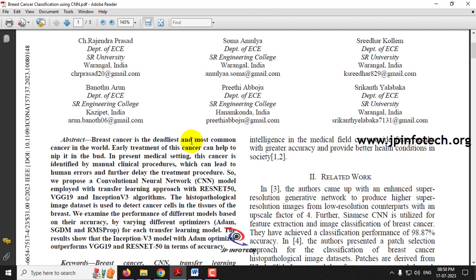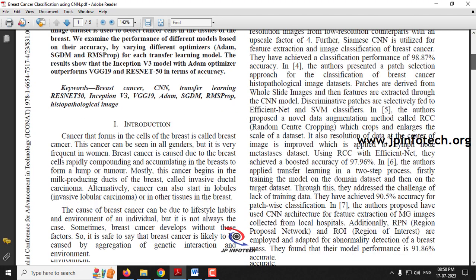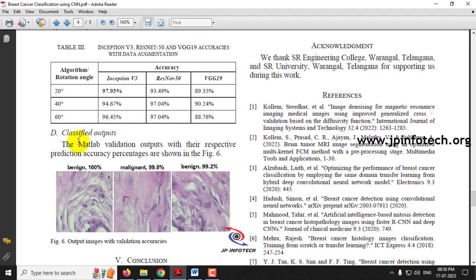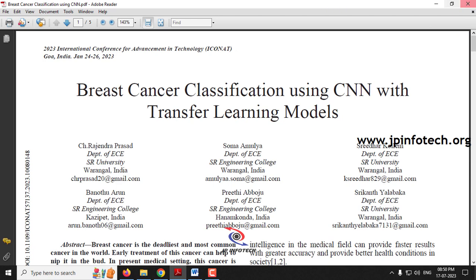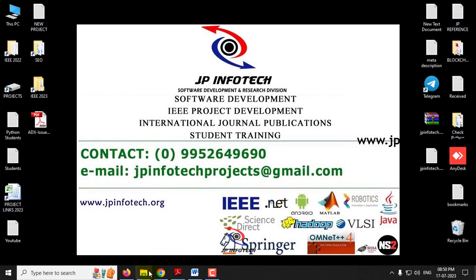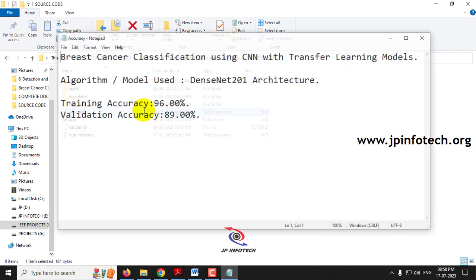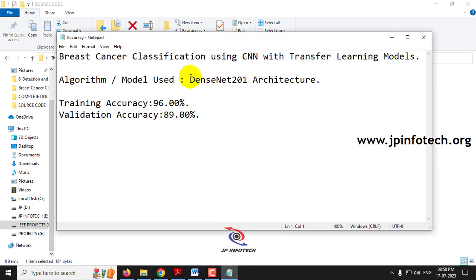In this paper, the authors have proposed a model for breast cancer classification which uses the Inception V3 algorithm. The authors implemented it using MATLAB. However, we are not going to use MATLAB — we are going to implement this using Python. As our proposed model in this project, we are going to implement the deep learning model DenseNet 201 architecture.